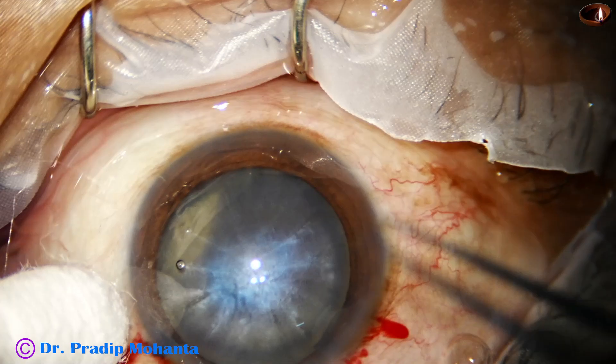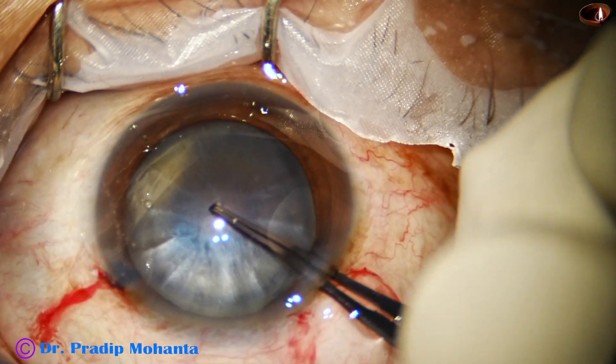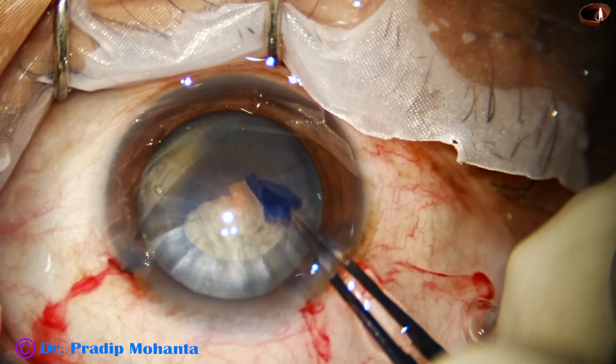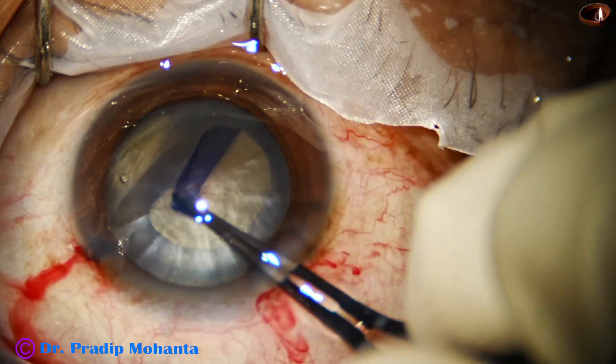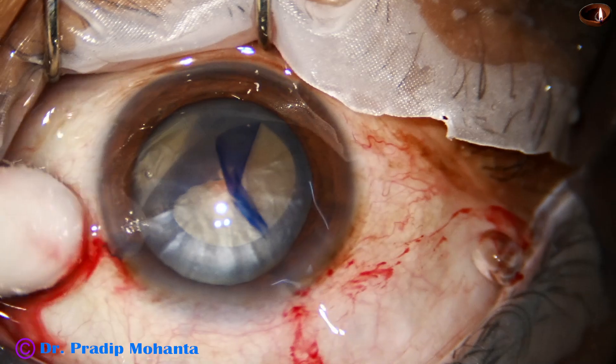Utrata forceps is being used to do the rhexis. There is some convexity of the anterior capsule — a mild intumescence is there, and some amount of oily fluid came out. Now, see what happens.